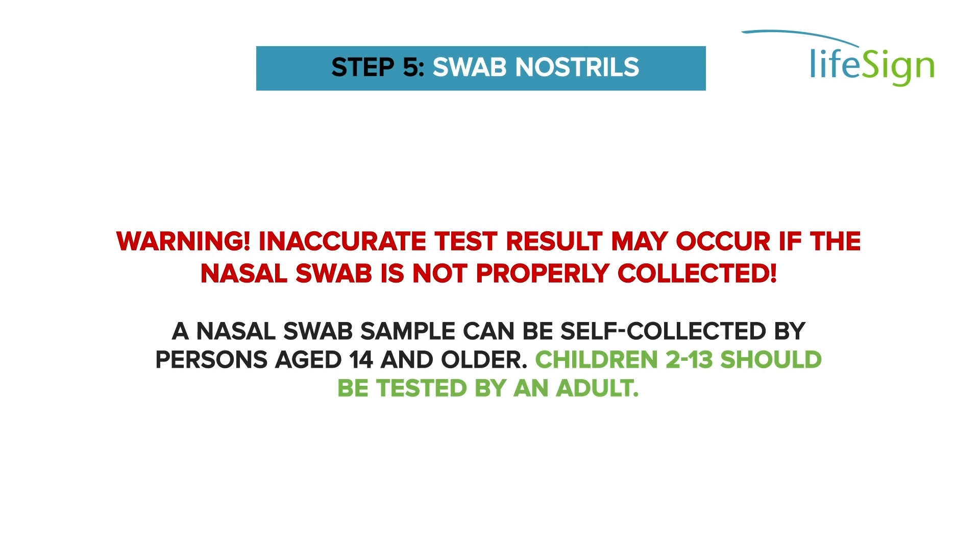Gently remove the swab and repeat in the second nostril using the same swab. A nasal swab sample can be self-collected by persons aged 14 and older. Children 2 to 13 should be tested by an adult.